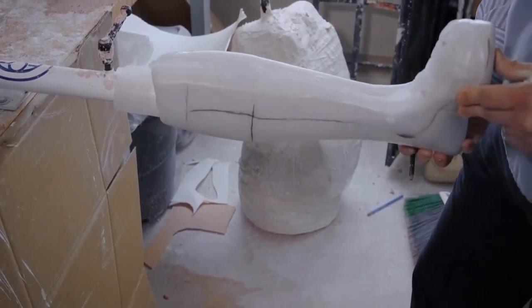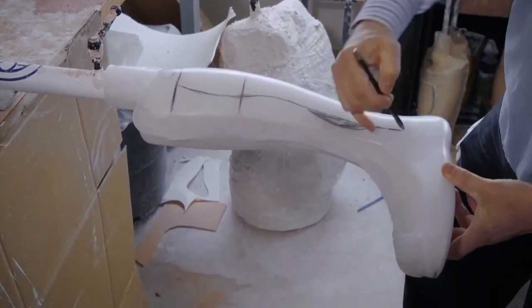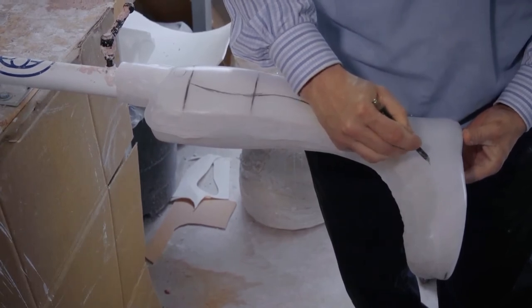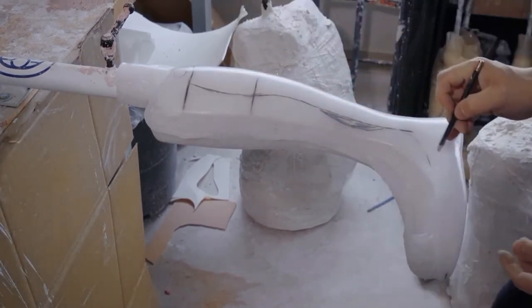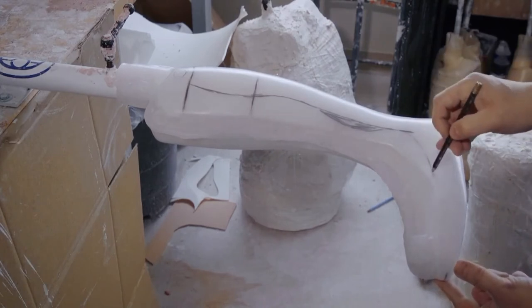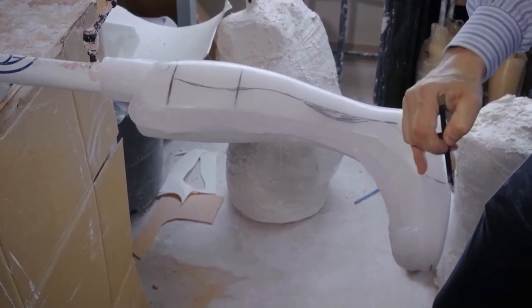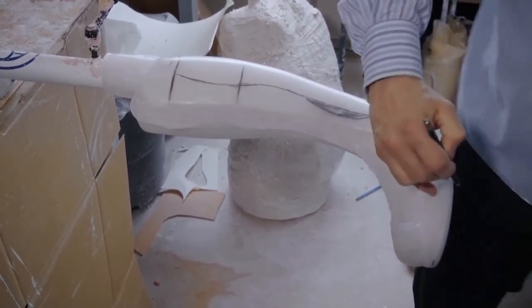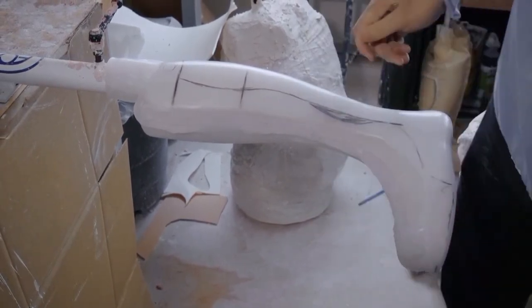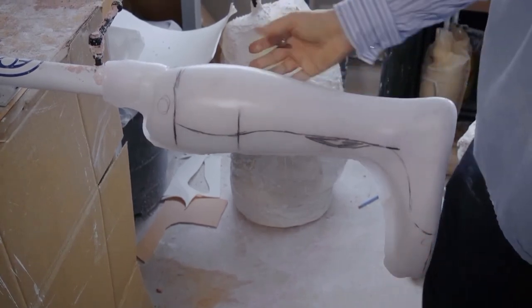So now we're just going to continue on. We're bringing the lateral side of the trim lines down here, and we're coming behind this bone right here on the lateral side of the foot. And we'll make this again full foot as needed. The height of an AFO is very important. There's a couple reasons for that.